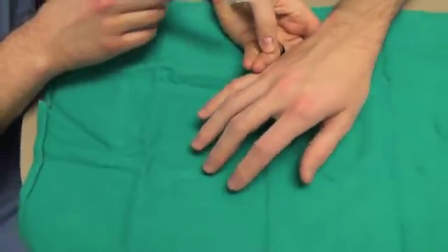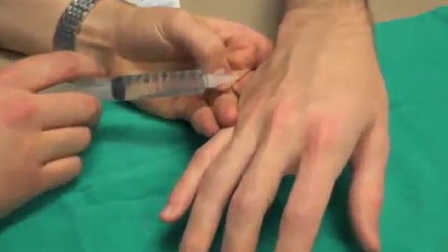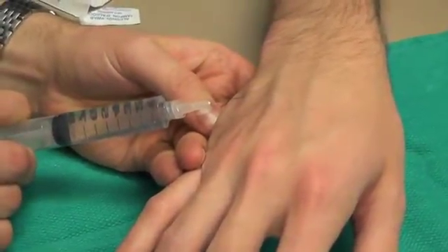The first injection will be a subcutaneous bleb that should take away the pain of the injection by anesthetizing the skin of the affected area.